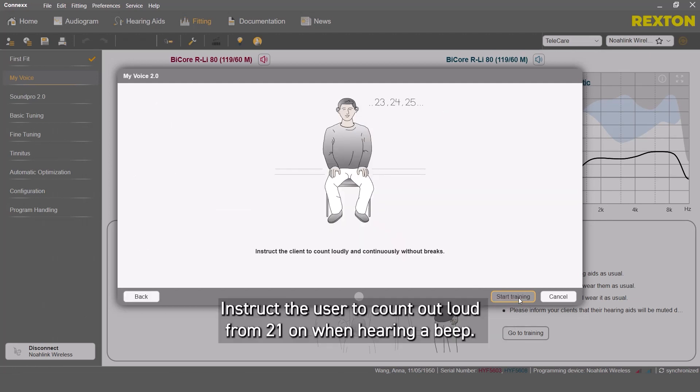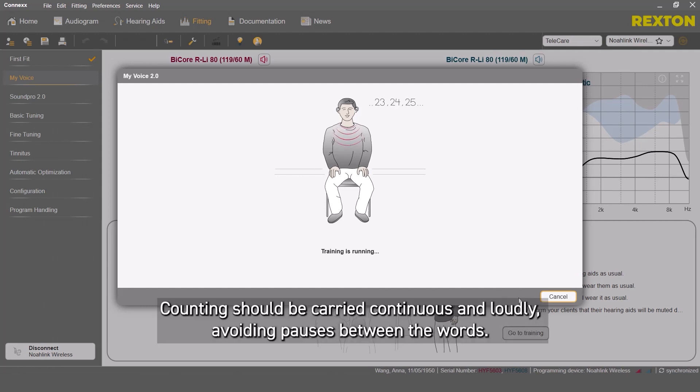Instruct user to count loud from 21 on when hearing a beep. Counting should be carried continuous and loudly, avoiding pauses between the words.